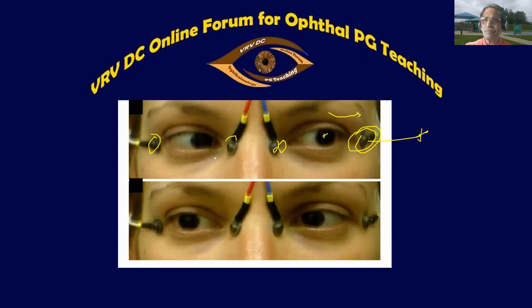You record the potential differences, positive, negative. They can find out in dark. You can record the potential difference in dark. The minimum potential difference you can record is called the dark trough.